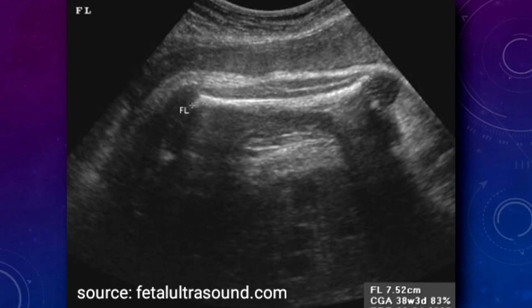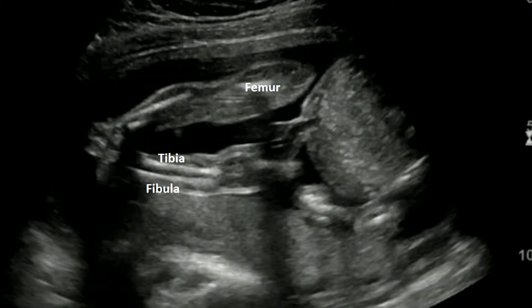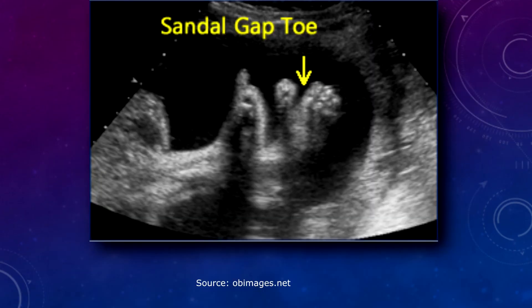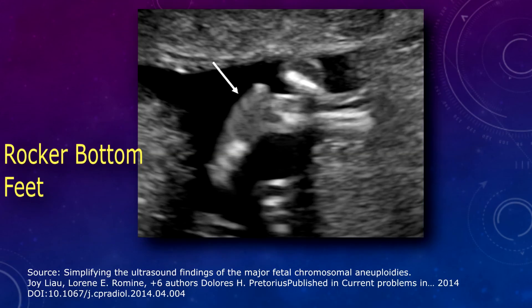Going into the lower extremities, your first stop would be at the femur. Here, you can measure the femur length, which is your last measurement for a general second trimester OB ultrasound. You want to make sure there are bilateral femurs, bilateral tibias and fibulas. You want to see the feet and all the digits. In the feet, you can see things like sandal gap or rocker-bottom feet, which are markers for fetal anomalies or trisomies. You can also rule out club foot.